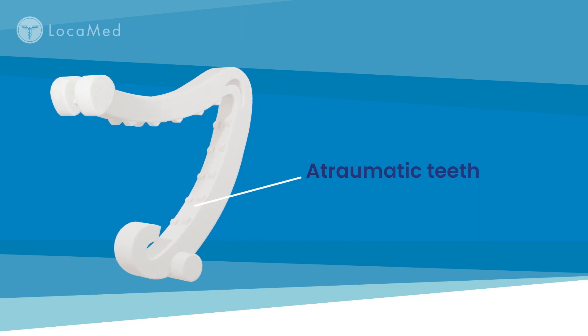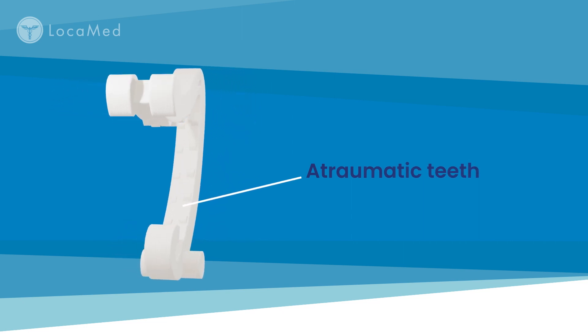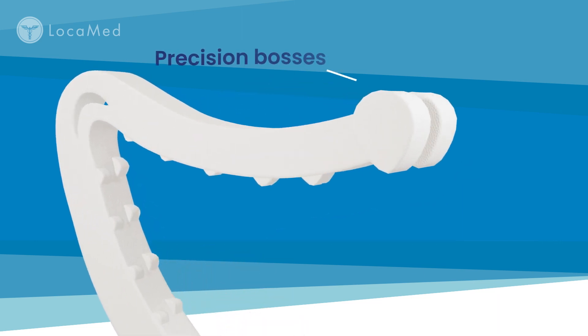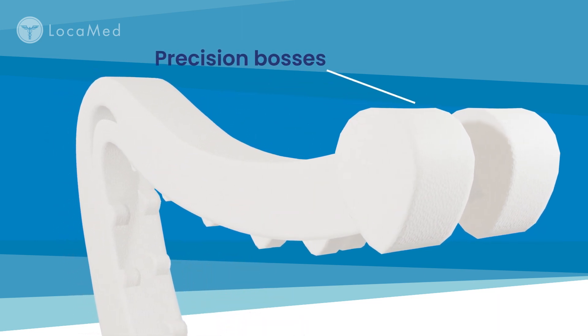LocaMed polymer clips have integrated atraumatic teeth which interface with the vessel to prevent slippage. Precision bosses retain the clip securely in the applier jaws.